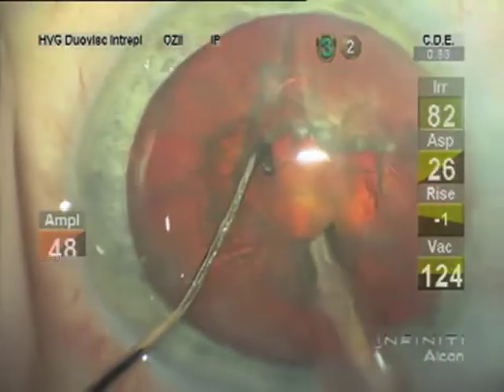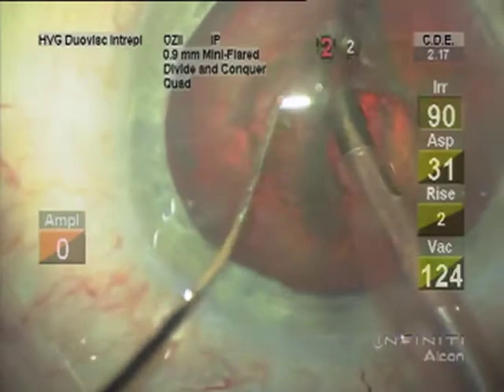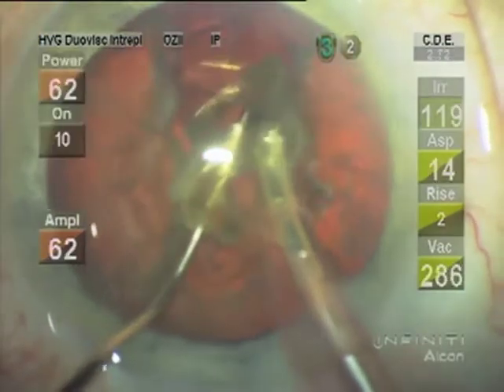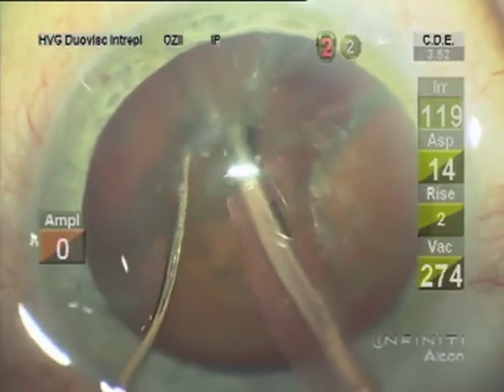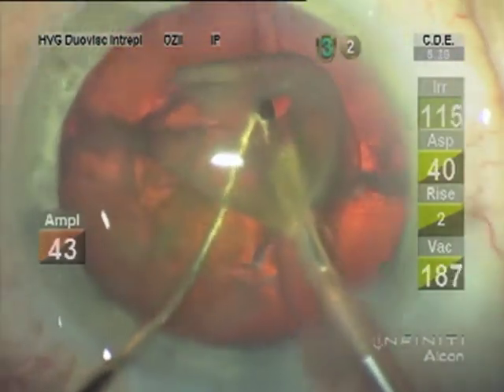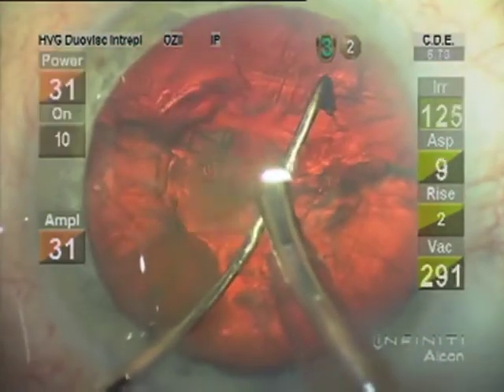I sculpt only enough to get deep into the lens to create the initial fracture, which doesn't always extend all the way across, but I start the segment fracturing and removal and complete the fracture to the other side as necessary. I like making small sections — the denser the nucleus the smaller the sections — and this Alcon Infiniti machine has good followability with the OZil tip at 100% and the IP setting. You can see the vacuum settings on the right and the aspiration at 40.